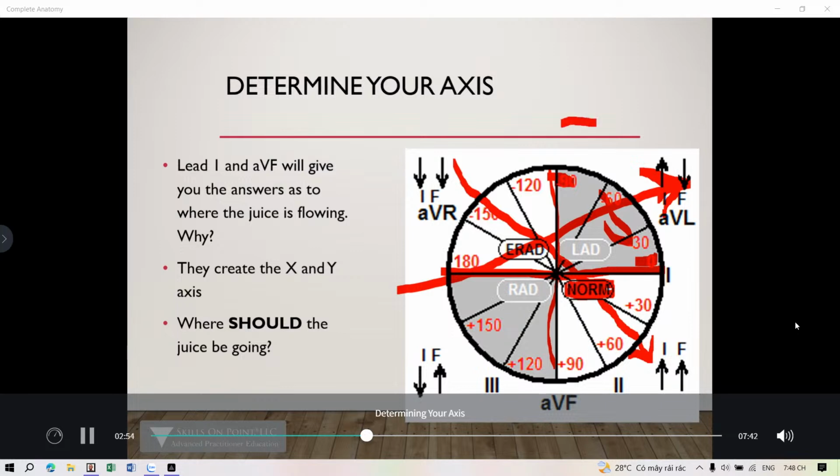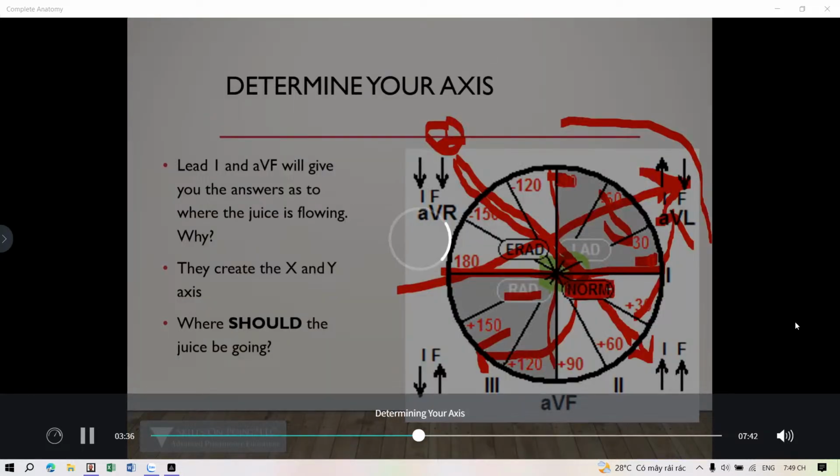So this band here is a left axis deviation. So the pendulum has swung towards the patient's left. If you imagine a pendulum at the rear of this, up here, let's say, it swings straight down here in a normal axis, and it has swung over towards the left. So it's a left axis deviation. Likewise, the right axis deviation would be.